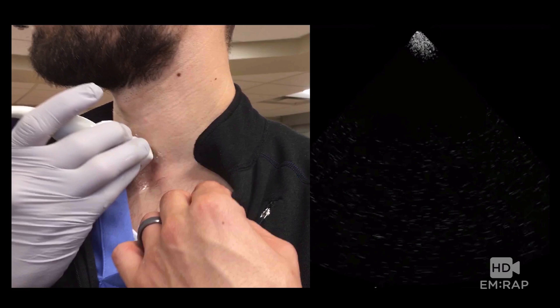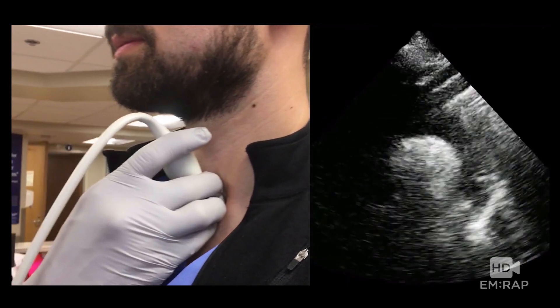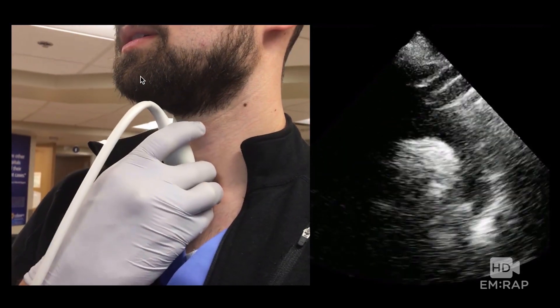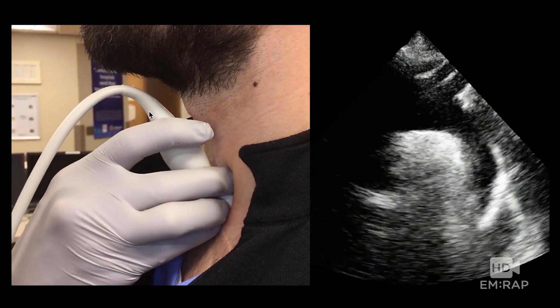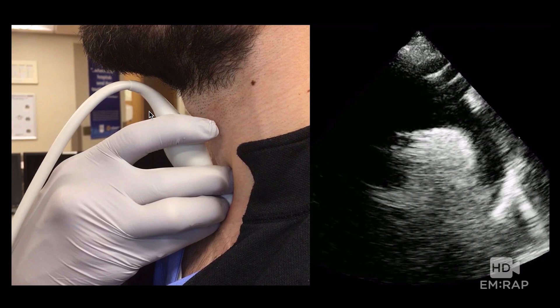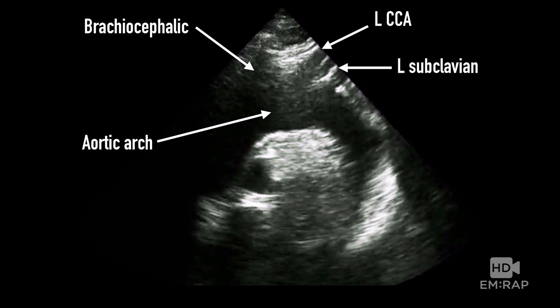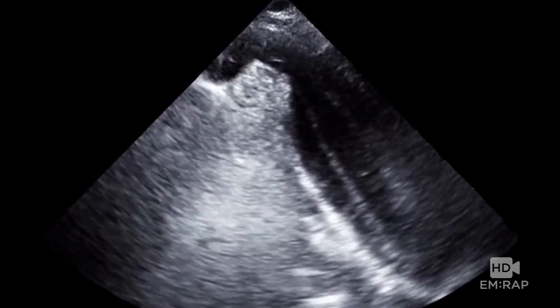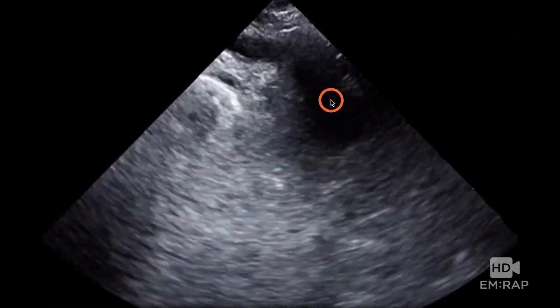You can also get a pretty decent view of the aortic arch as a whole by placing the transducer in the suprasternal notch. You have to put a little bit of pressure in that suprasternal notch, and I often have the patient put their chin to one side so I can get the probe down into the arch. You're applying a fair bit of pressure, but it's necessary to get this beautiful arch view. Make sure to use your phased array transducer for this. Here we have our left common carotid artery, left subclavian, brachiocephalic, and the aortic arch. In this dissection example, you can see the aorta is dilated and there is a dissection flap there and another one up here.